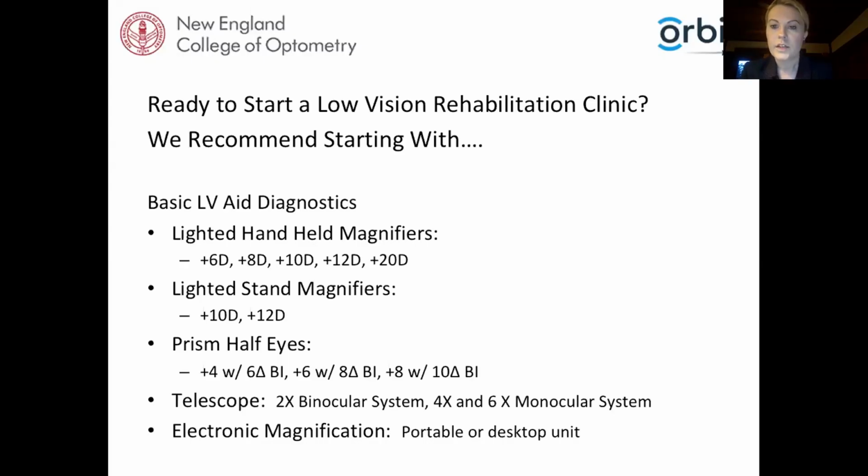The first question is, how do I choose the correct or best low vision devices with so many limitations in my country? In this case, the country is Indonesia. In your region, there are suppliers in Asian countries that make low vision devices at a lower cost for non-profit organizations, so I could give you some information there.